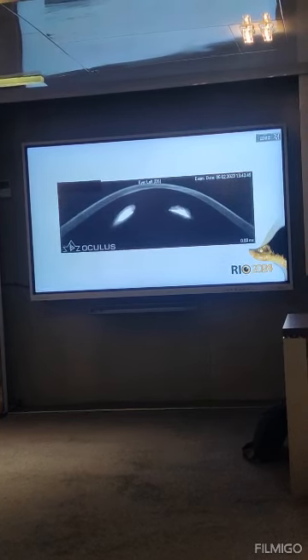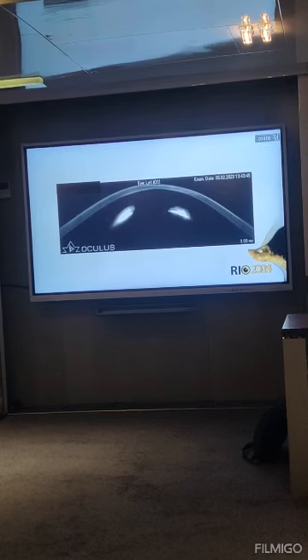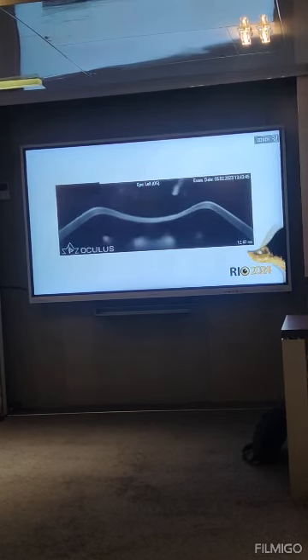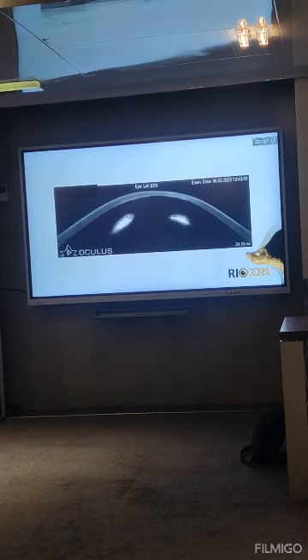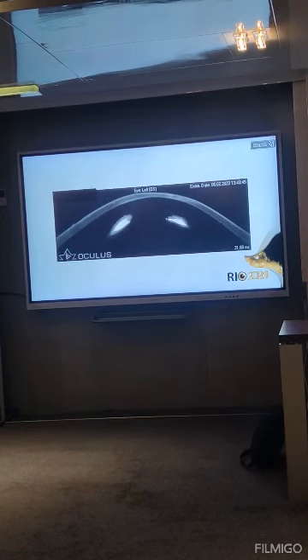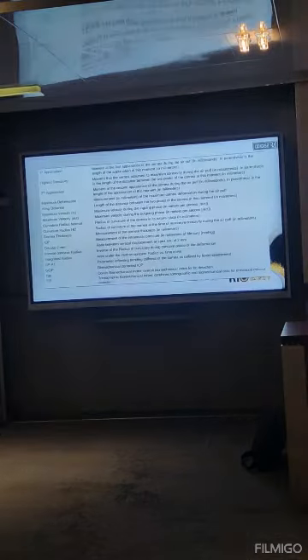Let's have a look at a weak cornea, or a keratoconic cornea. This is an extreme case. I call it a dancing cornea. You can see how the cornea moves inwards more, assuming a higher concavity than the normal cornea, and the vibrations, oscillations, the timing, everything is different. It means this cornea is not stiff, or is very weak.